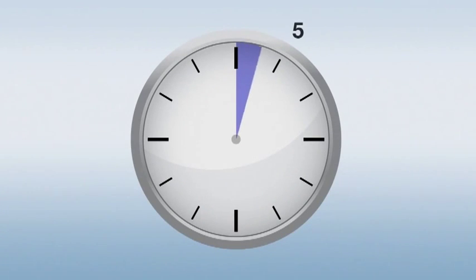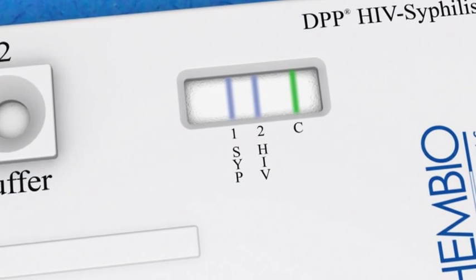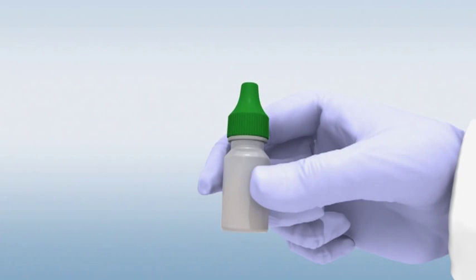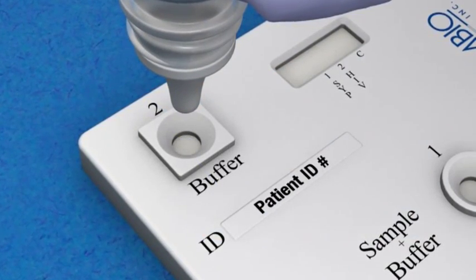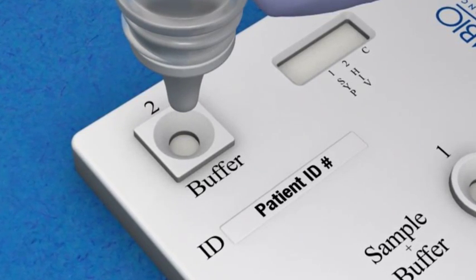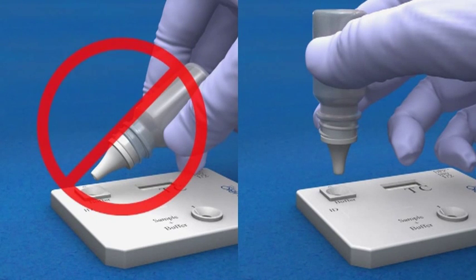Wait five minutes. Applying the buffer. Ensure that the colored lines have disappeared from the test window before you apply the buffer. Then remove the green cap from the running buffer bottle. Hold it in a vertical position but upside down, and gently apply four drops of buffer into the square buffer well, without touching the bottom of the well with the tip. Be aware that holding the bottle sideways will produce invalid results.